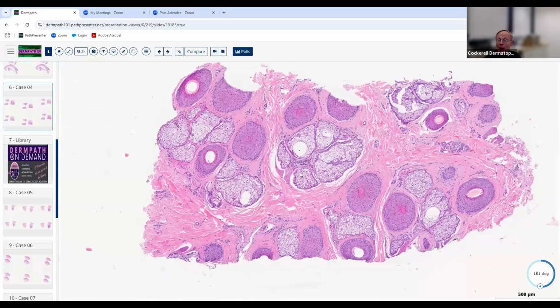This almost looks like a biopsy from the face. That's cut horizontally, but it almost looks like a biopsy from the face. If it looks like it's the scalp and it kind of looks like the face, then you should be thinking of androgenetic alopecia. So the person might have background androgenetic alopecia. And in dermatology, more than dermatopathology, dermatology is really a microcosm of almost all of the specialties of medicine, right? We've got pediatrics, we've got internal medicine, we've got surgery, we've got dermatopathology, we've got psychiatry.